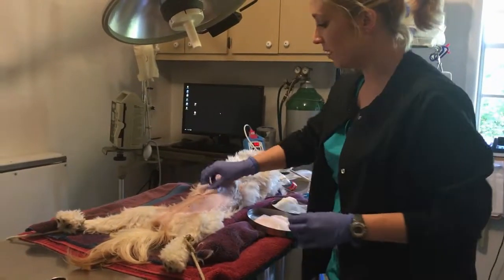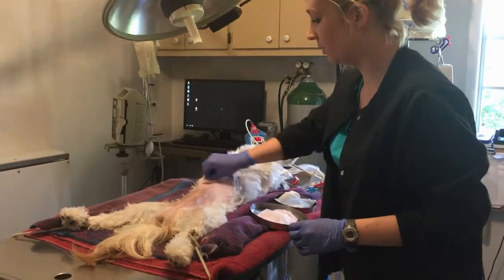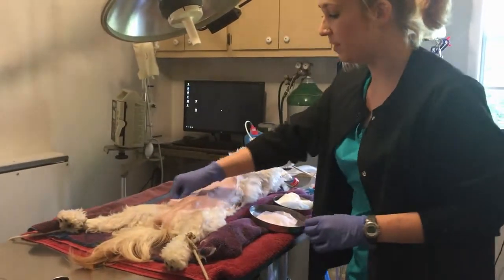I'm going to do a quick swipe scrub again just to make sure nothing was contaminated during transport.